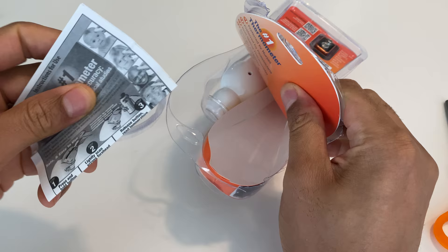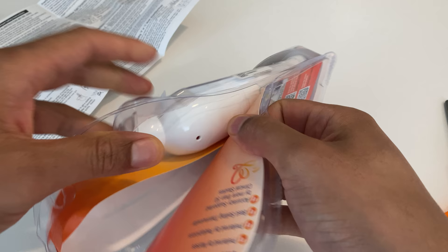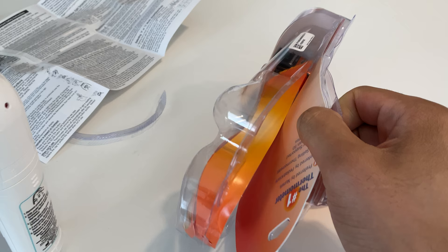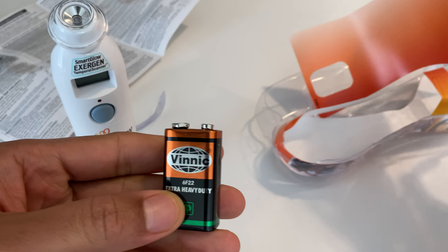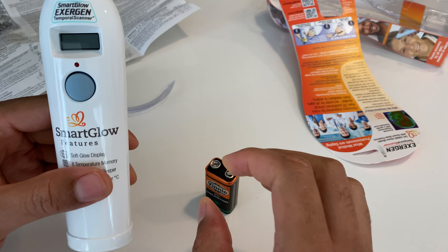On the inside there's an instruction manual — I'll save that for the restroom later. Here is the actual device. I have to cut a little bit more because the plastic is somewhat sharp and I don't want to injure myself and end up needing to go back to Target for a band-aid. I'm also going to pull the battery out — it says Vinnick, a brand I've never heard of, probably a generic brand made for this device.